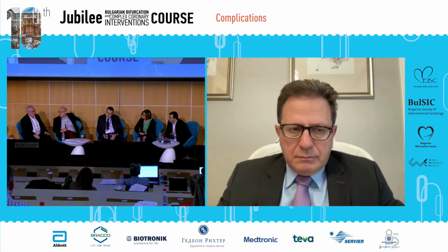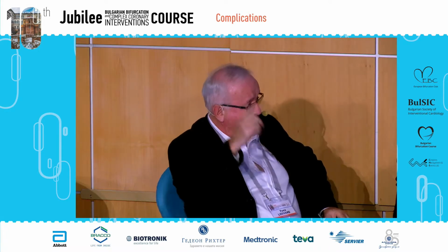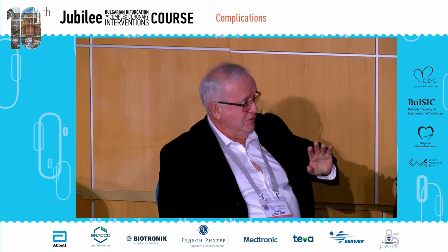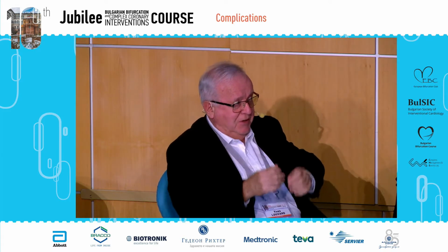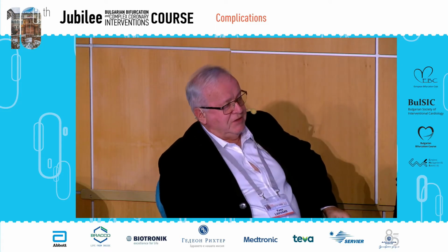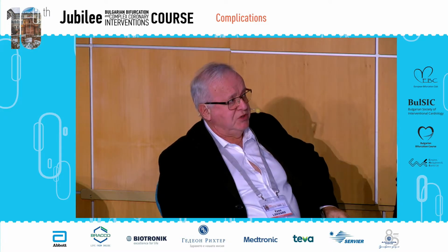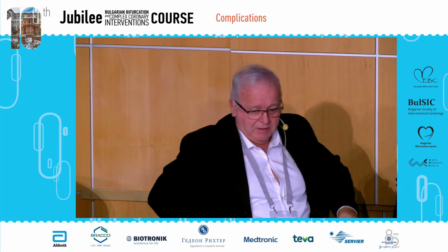I have two comments. First, this small high takeoff radial. Something we were always doing in such a small vessel was to go down a bit and look at the connection at the elbow level. At least a third of cases, sometimes this is very complex, a complete loop, and so on. And sometimes it's very easy, so you can move to the bigger vessel. So this was the rule. You see a high takeoff, go down, inject, look for the connection. And after the dissection, I would have nearly the same position as Robert.